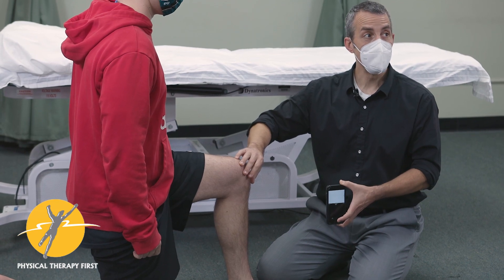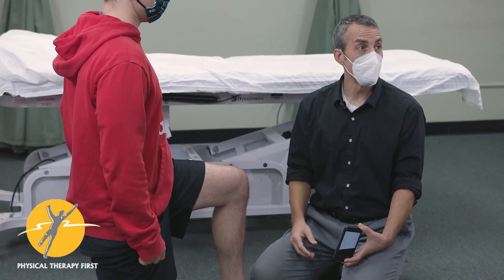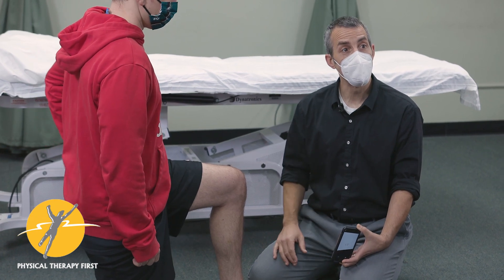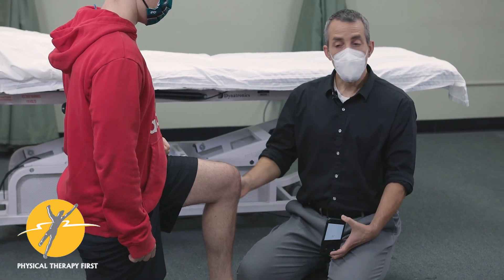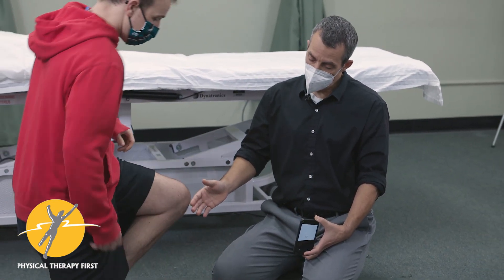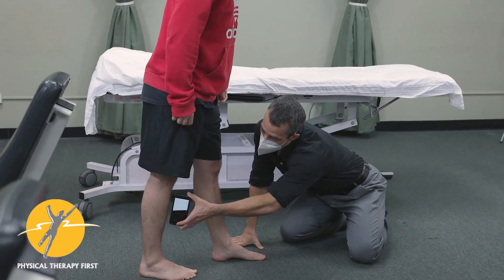For some patients who won't like that half-kneeling position, you might want to put a pillow under their knees. It just keeps everything clean when you're doing it, though it is a little bit more difficult.